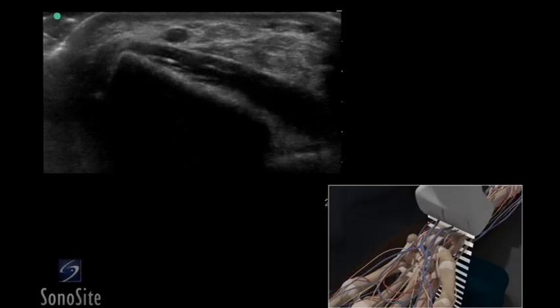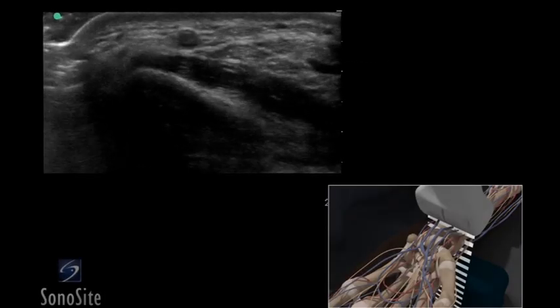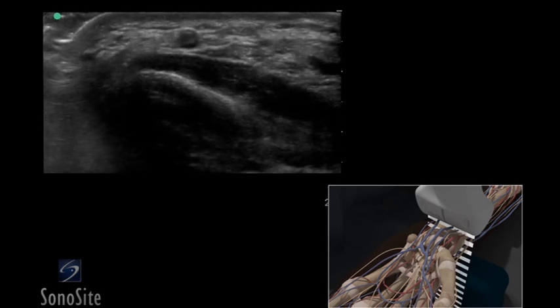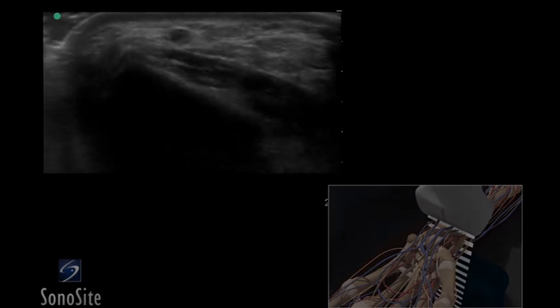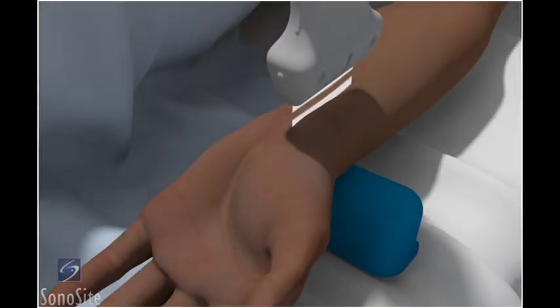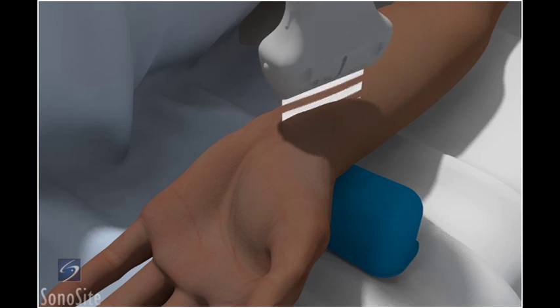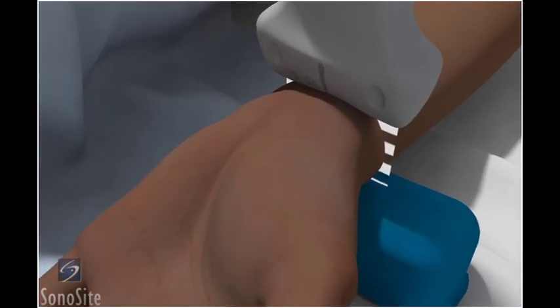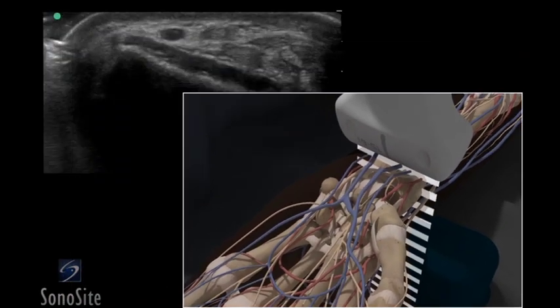A linear array transducer with a vascular exam type is used to perform an ultrasound-guided insertion of a radial artery catheter via a transverse approach. The patient is in a supine position with the arm abducted 45 degrees and externally rotated. The wrist is extended by placing a small roll beneath the wrist crease. The transducer is placed transversely just proximal to the wrist crease with the orientation marker directed to the patient's right.